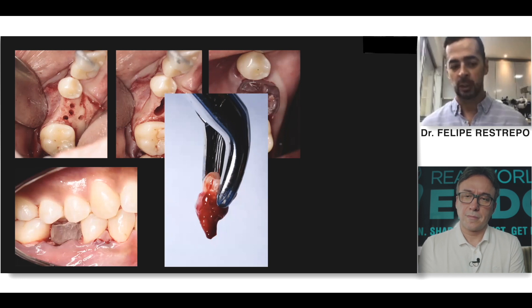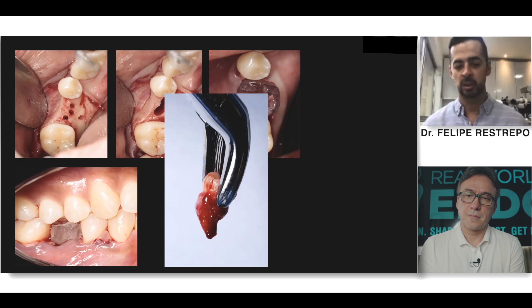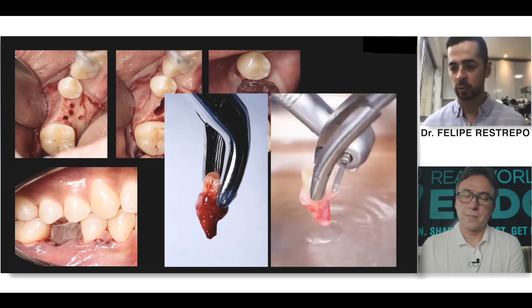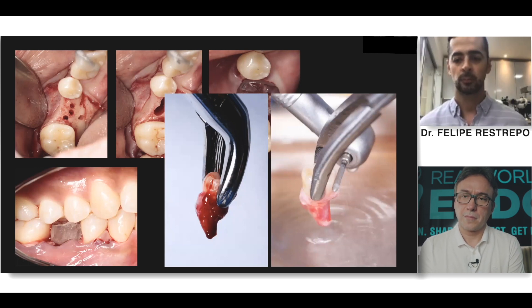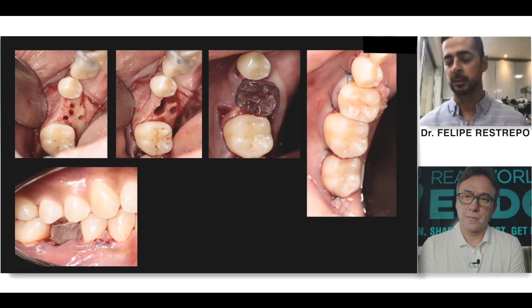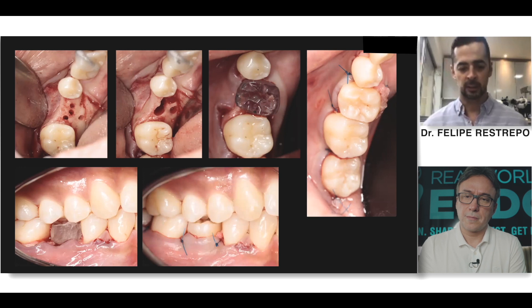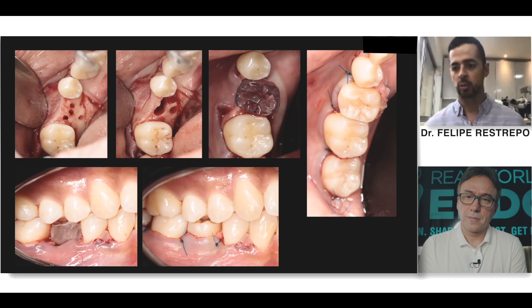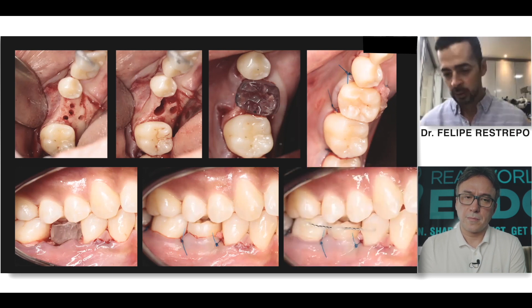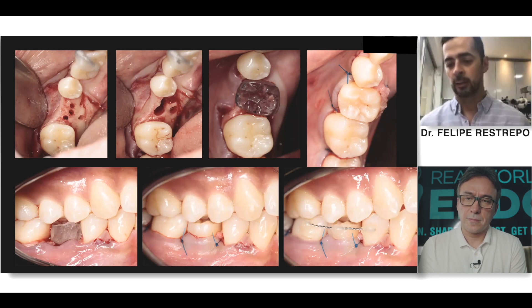Since with the 3D replica we had to do a little bit of grinding on the mesial and buccal side, we try to replicate those adjustments on the actual tooth without touching the root — always handling by the crown. Then we place it. Look at the similarity between the 3D replica and the actual donor tooth. And then we do the splinting — in this case, orthodontic wire and resin composite.